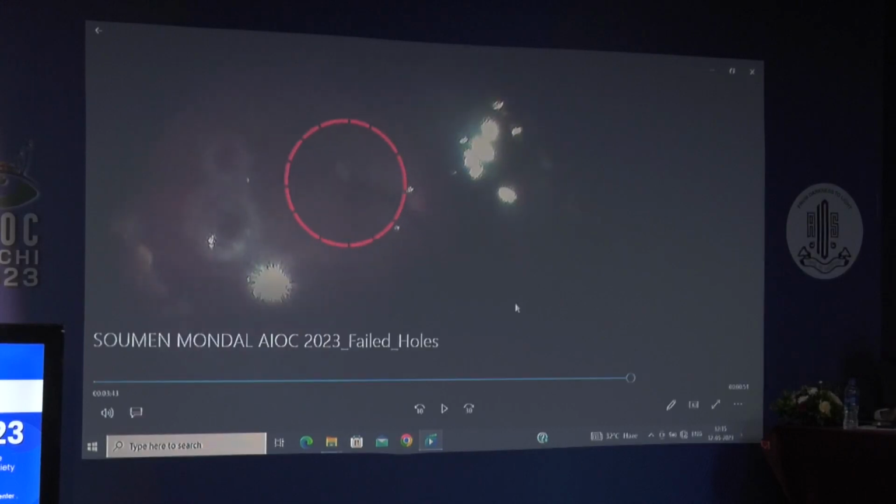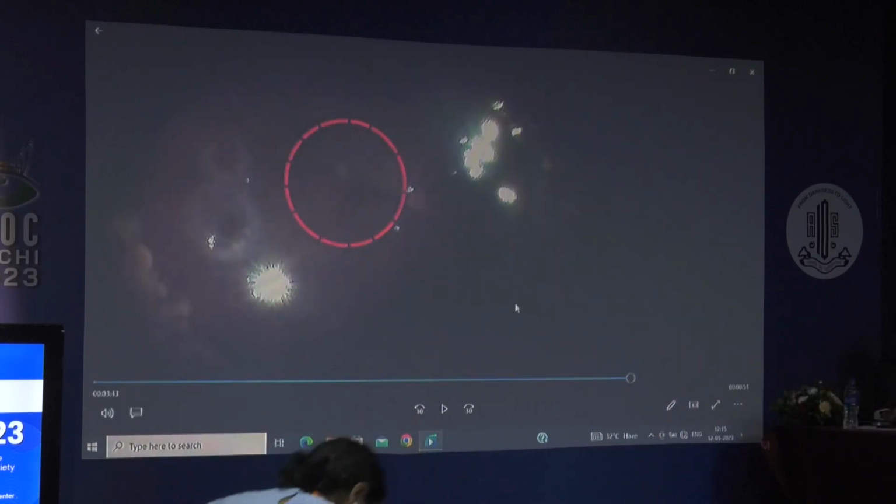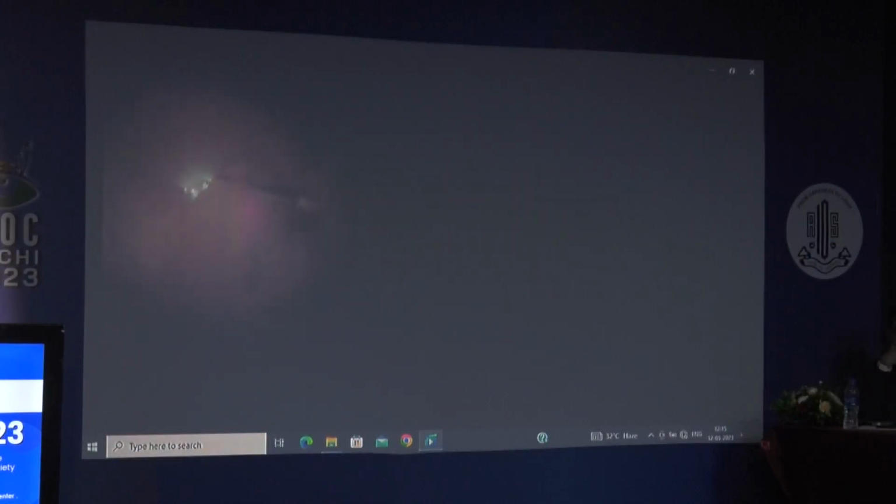Another situation that can happen is, once I've put the graft, everything in place, I'll end the surgery now. I'll put silicone oil and end the surgery. The moment the silicone oil comes, it drives the graft away from the junction, from the hole. This is what's happening now. There, my graft has flown away. So with the silicone tip, I'm again trying to take it into the hole.